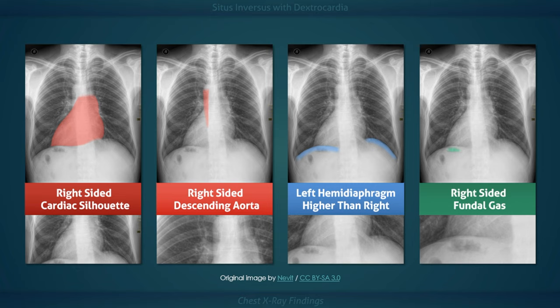In patients with situs inversus totalis, you would expect to see a right-sided cardiac silhouette, descending aorta, and gastric air bubble, while the left hemidiaphragm will be higher than the right.